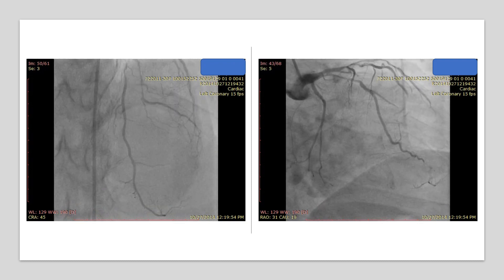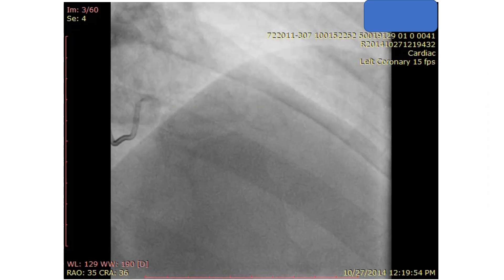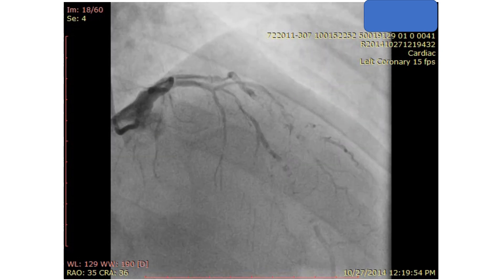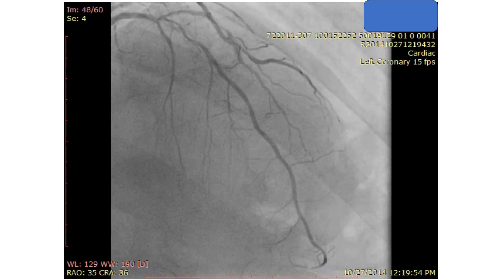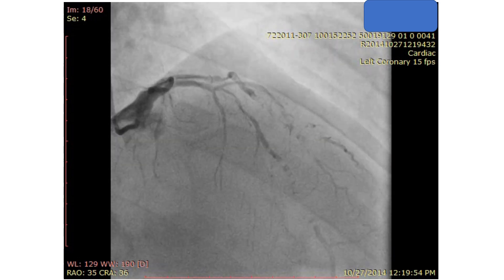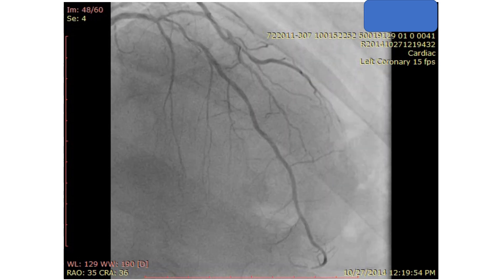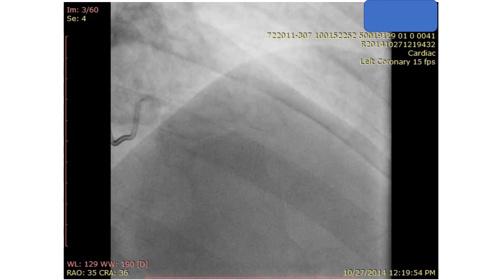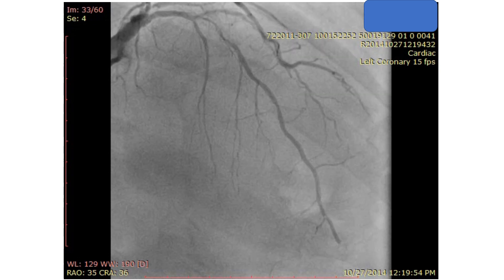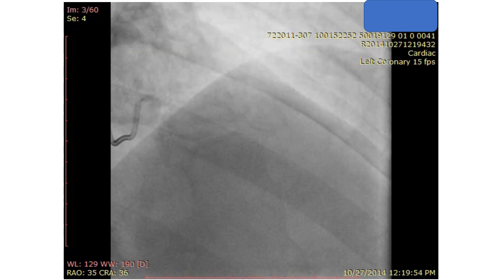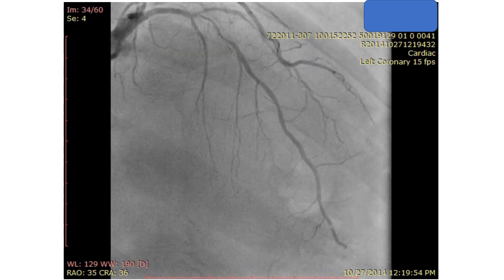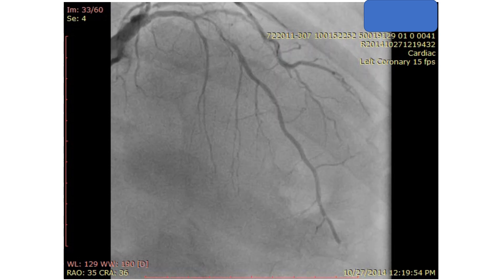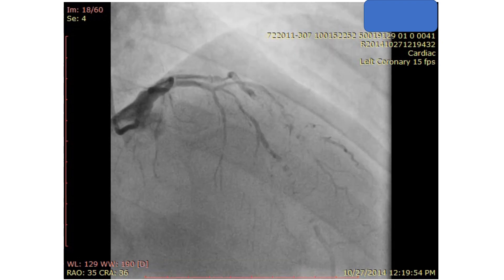So what happened? The explanation can be found in the view in between — it shows a significant air embolism. This case emphasizes the importance of paying attention to the injection system: the manifold, the syringe, etc. The embolism occurred at our site, but in other cases it may not be visible and may occur while flushing the system. The patient had a transient chest pain and hypotension that resolved in a minute.